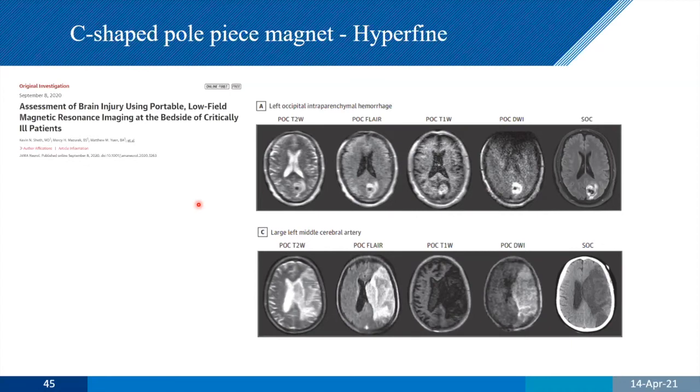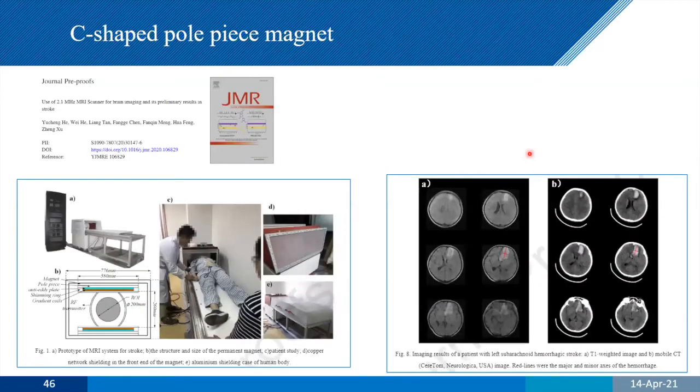And what you see, I think, is the good side and the bad side, right? Some of these images are really pretty impressive here. And when we look at diffusion, then there's a way to go. And that's great, right? Technically everything looks good, but it's not as if every problem has been solved. And then a very similar design coming from China, also looking at stroke patients with the 50 millitesla here and comparing with CT.